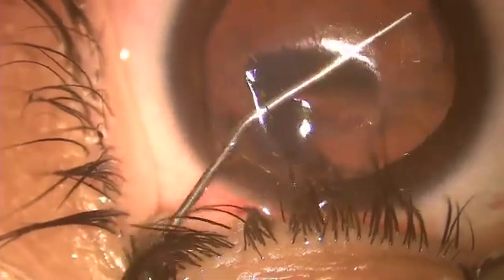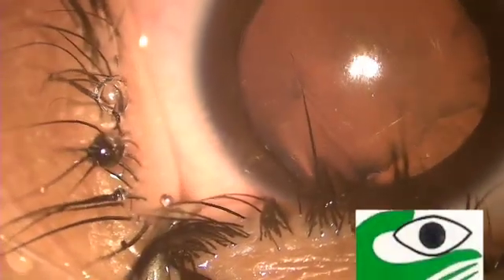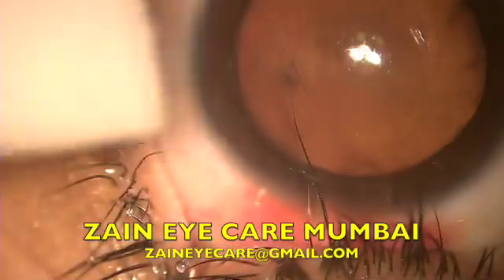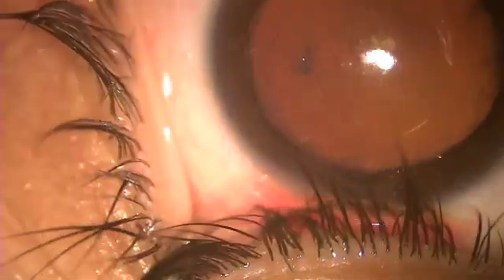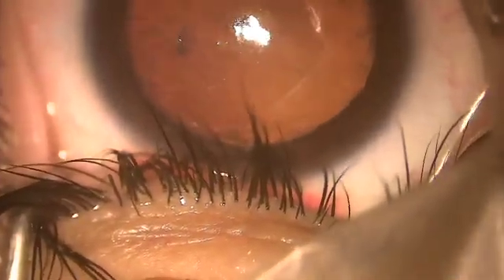Around a minute, one and a half minute of wash and iron is important. Here you can see now the folds are becoming a little bit lighter. Again ironing, wash and iron, wash and iron. There's a little bit of epithelial. Sometimes what we need to do is do a little bit of epithelial debridement if you're taking up the case after a few days or a few weeks.